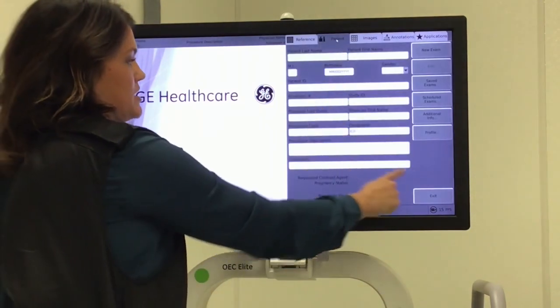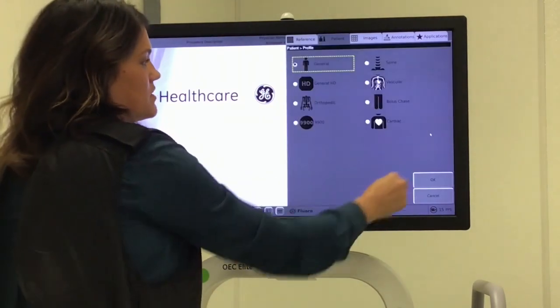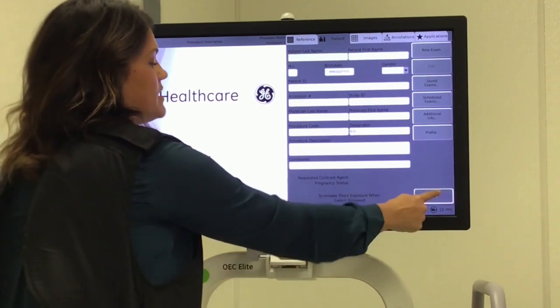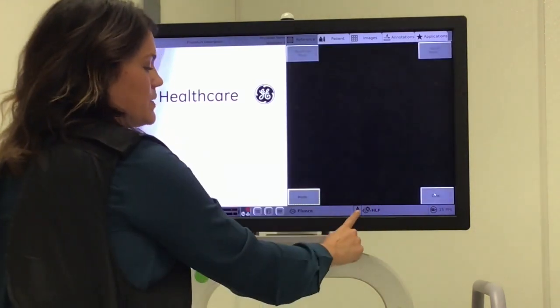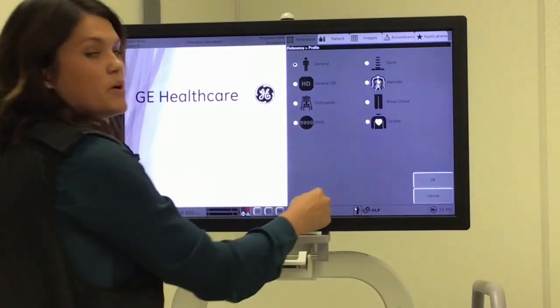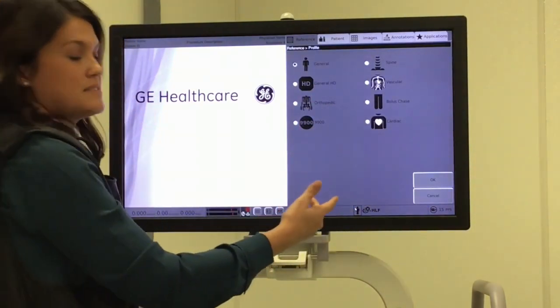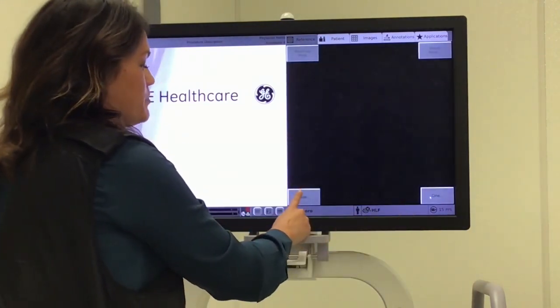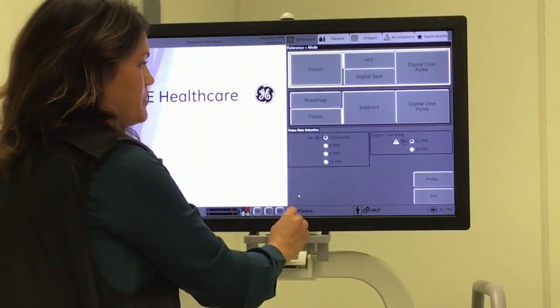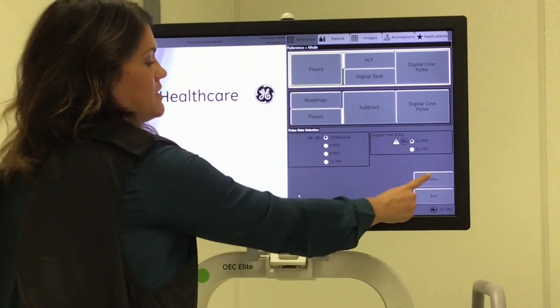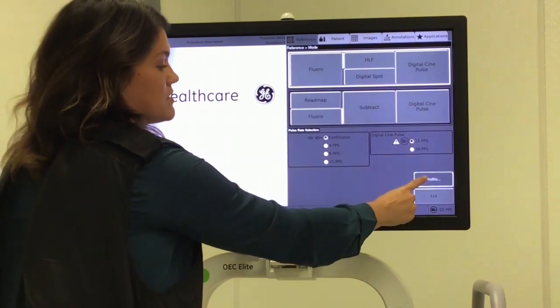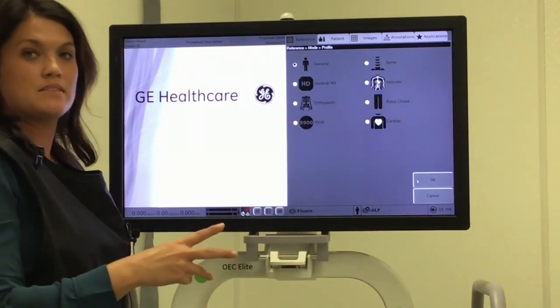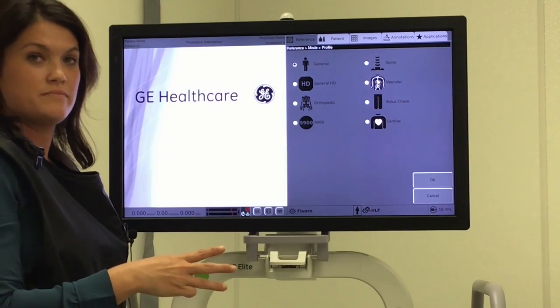So you can either open your patient and go to Profiles, or if you're in a case and want to quickly touch the icon on the status bar, you get the same menu. If you're in Mode, you can click the Mode button and Profile is again an option there. So there are three different ways to get to the Profile menu to change it.